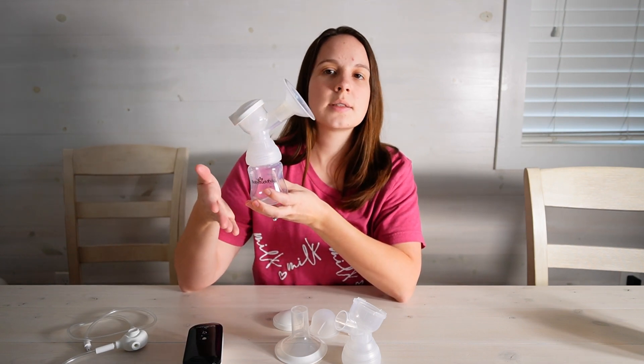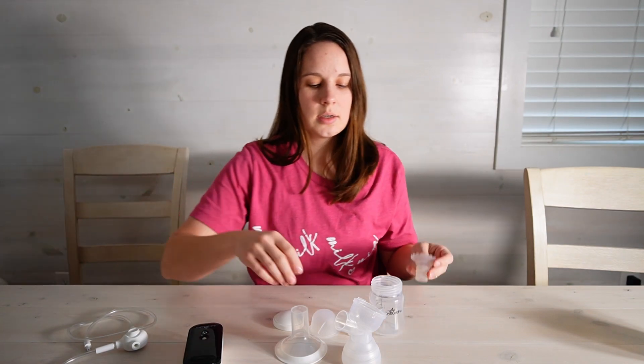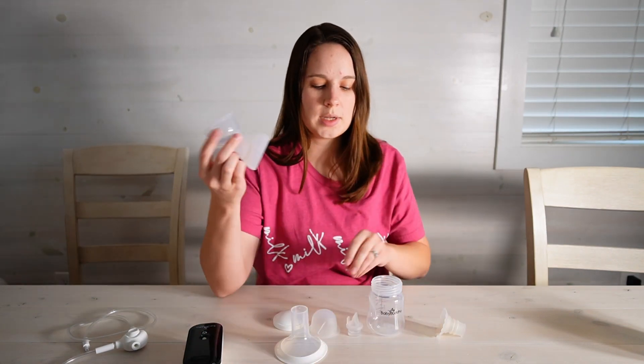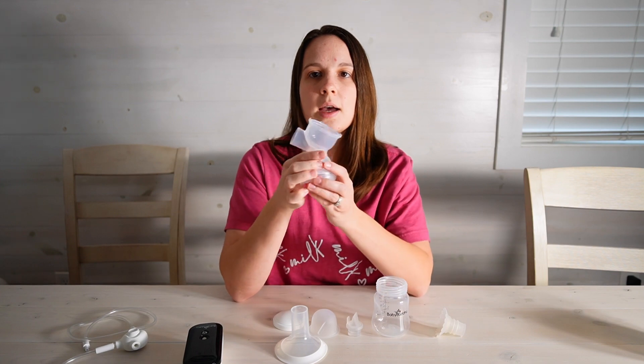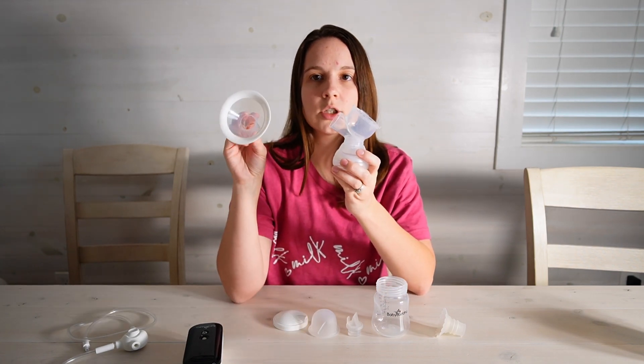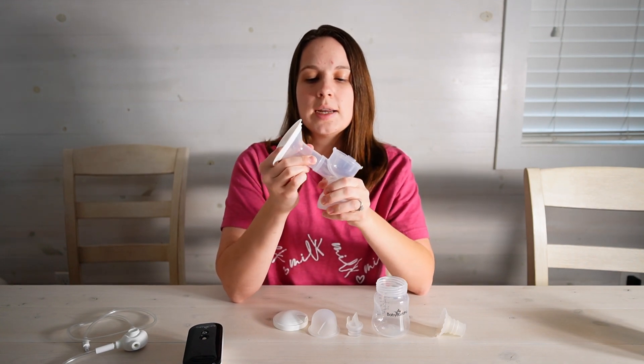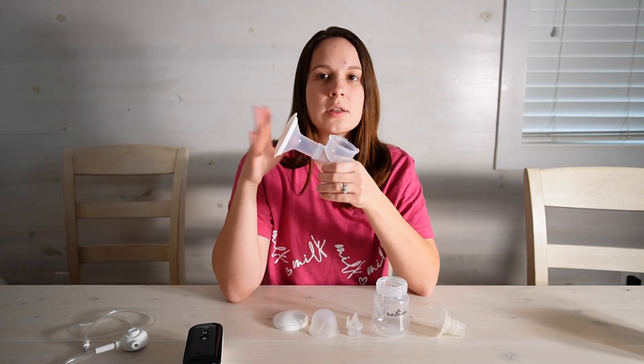This is the setup that comes with the pump. If you get the easy fit kit off the website it's the same thing except the base is cut off, so that way you can change out and use whatever flange you would like. This makes it very easy to customize the fit.